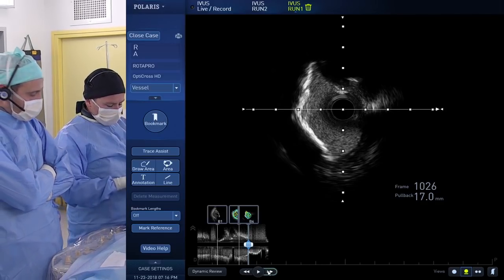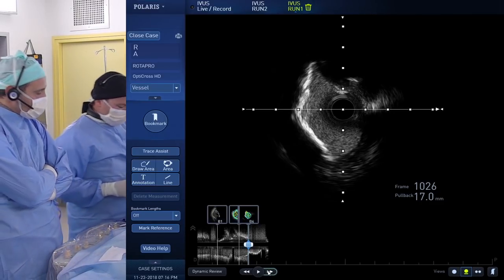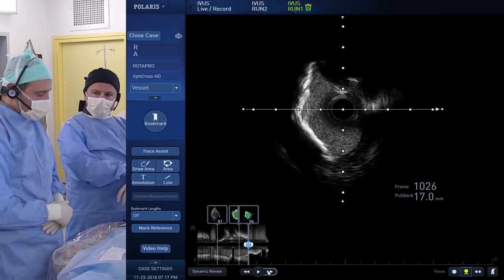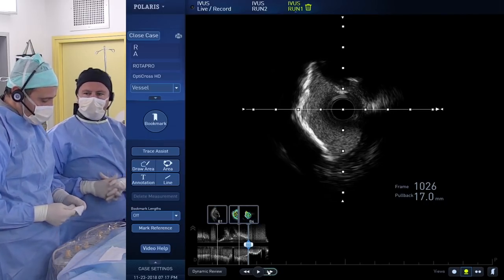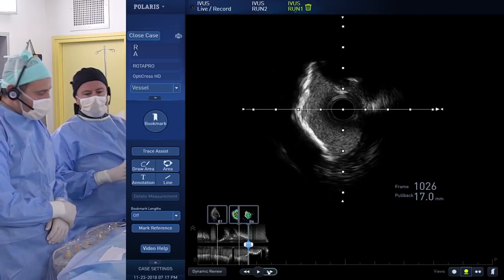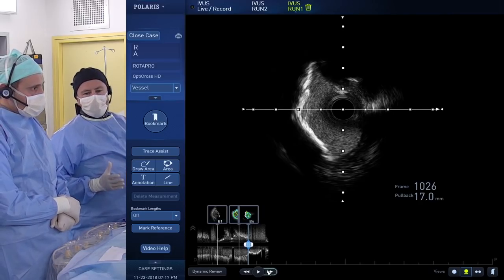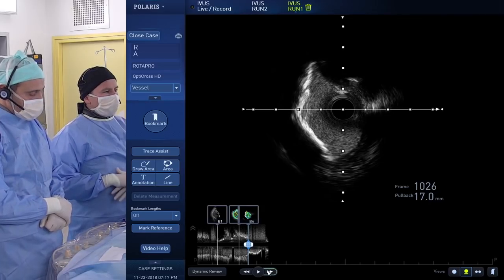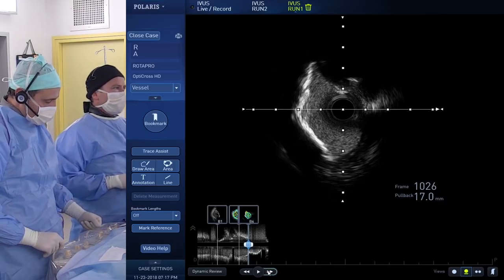The first thing concerning the long calcification in the LAD and in the left main: I think it's better to prepare the lesion, not with a balloon, but with rotational atherectomy. Thanks to that, we will prepare the left main and also the LAD, and then we will be able to place at least 2 wires to finalize the PCI with balloon preparation and stent implantation in the LAD, and I think in the left main.